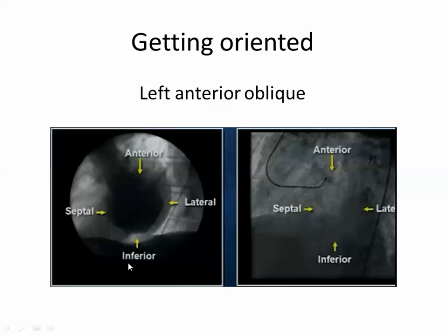While the interventricular septum or sulcus will be perpendicular to you. Okay, so when you take a cut section, you will see this as a circle or cut section, and this will be the LV, RV, okay, will be here. Okay, it's clear or not?